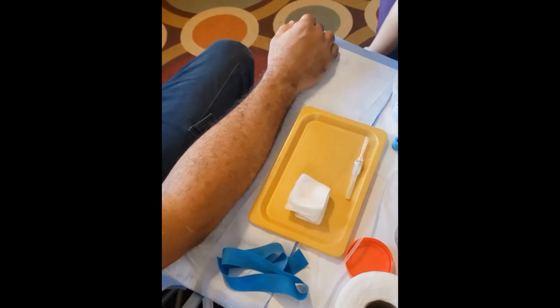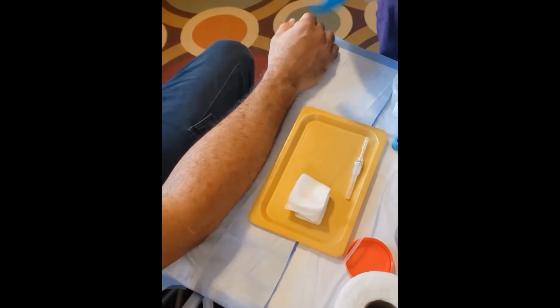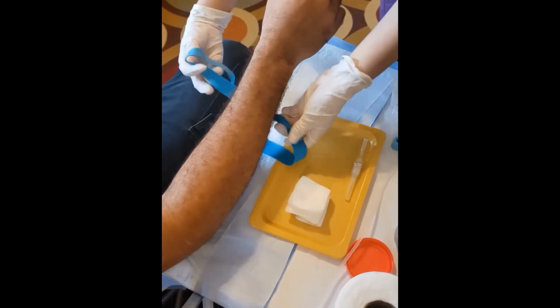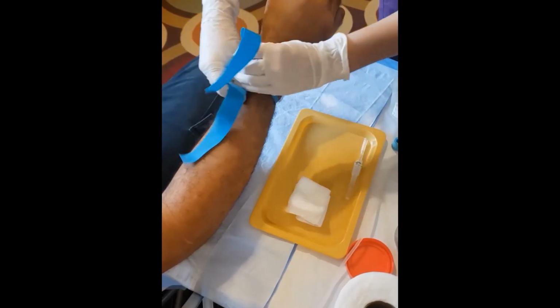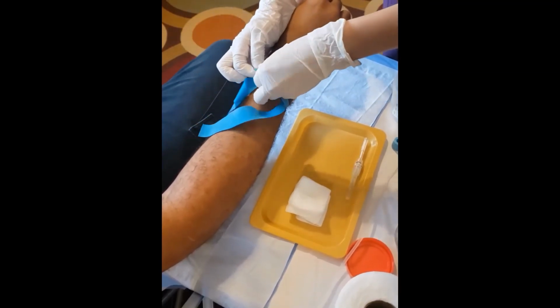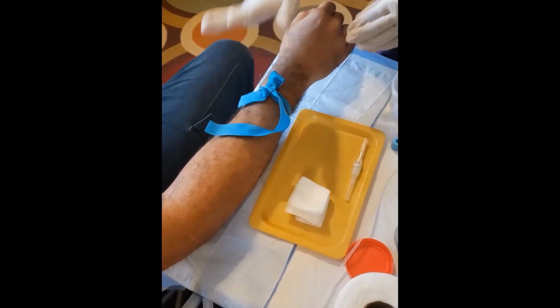The tourniquet must be tight enough to obstruct venous flow, but not so tight that it occludes arterial flow. Obstructing arterial flow inhibits venous filling. When dilating the vein, gravity slows the venous return and distends the vein. Distending the vein makes it easier to insert the needle properly. Apply a tourniquet about 6 to 8 inches above the venipuncture site.